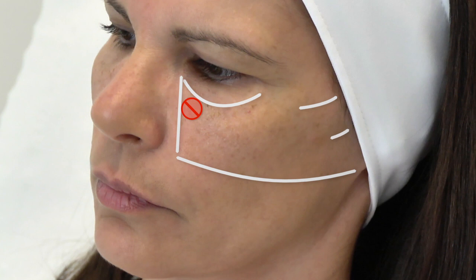Mark the limits of the zygomatic arch. These lines are very important in that the first insertion point must be at the middle of the zygomatic arch.